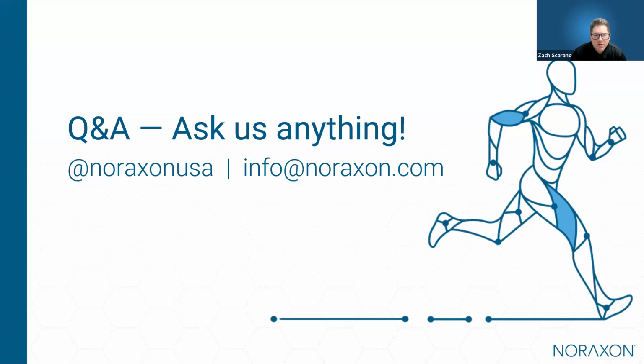Another question. Is the code from MR4 the same for this app? I'm assuming you're asking about the licensing, and no, this is a completely separate software product with its own licensing. If you're interested in purchasing this application, I would encourage you just to reach out to your local salesperson or distributor, and they can get you set up with pricing and a quote and get you that license.